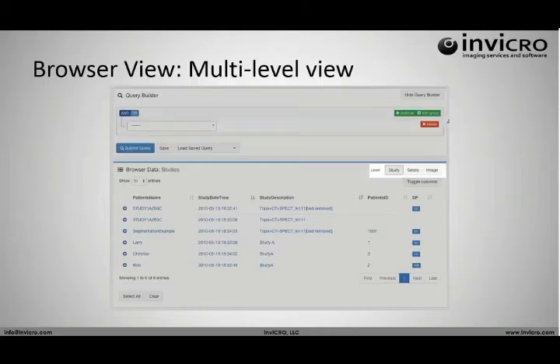In addition, you can now view, traditionally we combine the patient study level, and then you have this tree that lets you drill down to the image level from there. We've added support for viewing data on all three levels, not the patient level yet, just because the nature of our work doesn't really require it, but if it comes up or anybody asks for it, we could put it in.